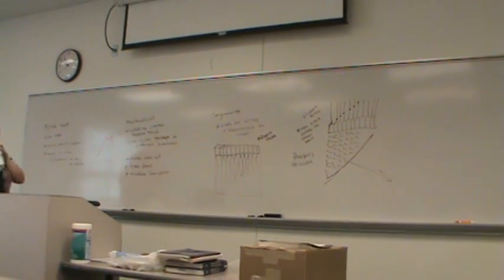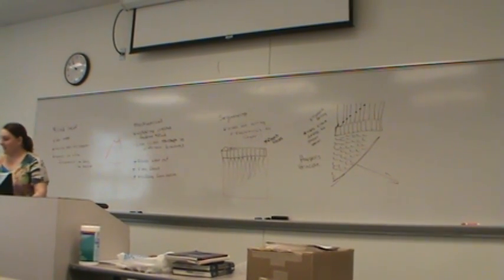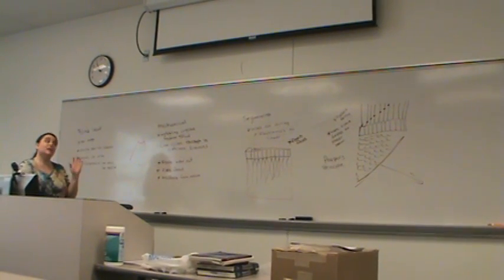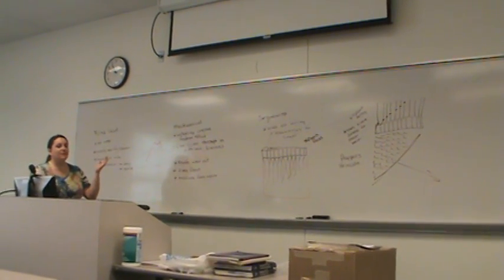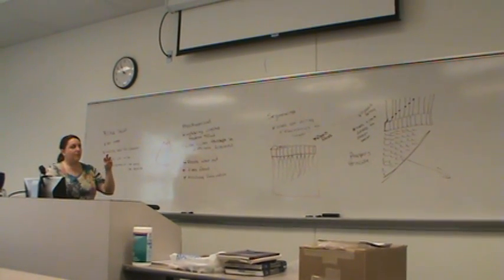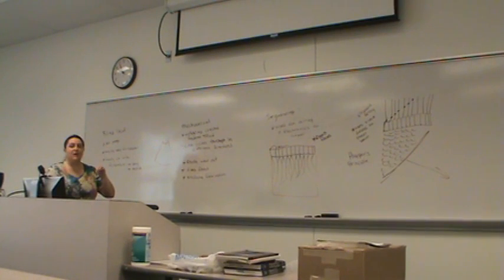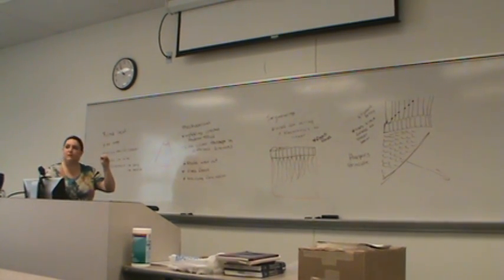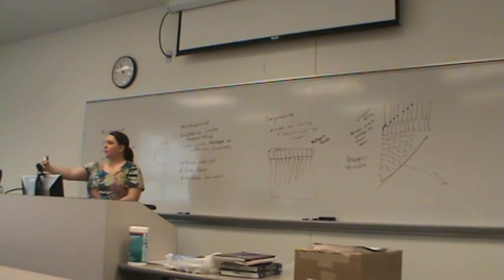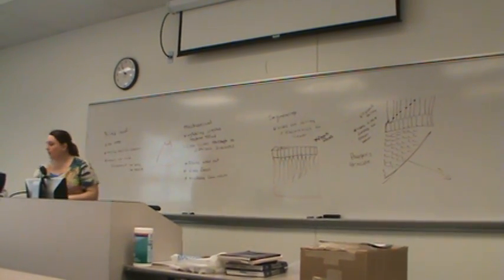But that's the basic idea, is that the system can create an ultrasound beam that's going the direction we want it to go by adding up all these little waves all together. So each individual crystal is making one little teeny tiny ultrasound wave, and then we're adding them all together to make one big wave go in the direction we want it to go.